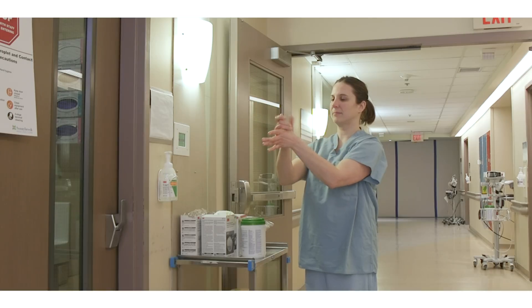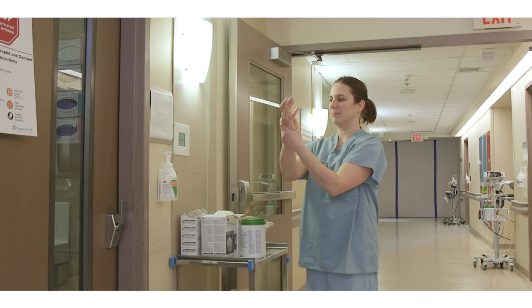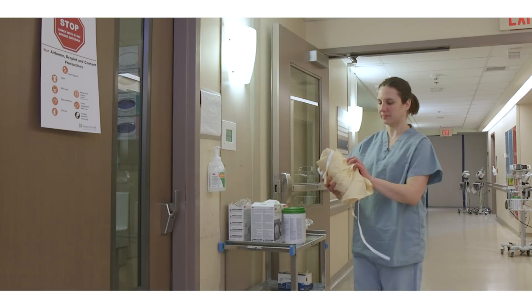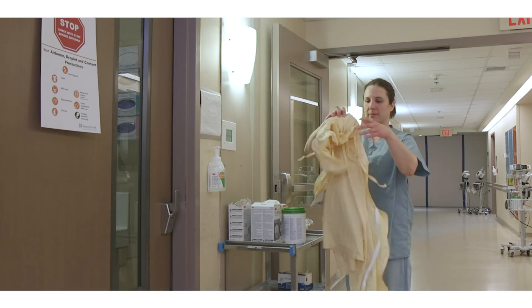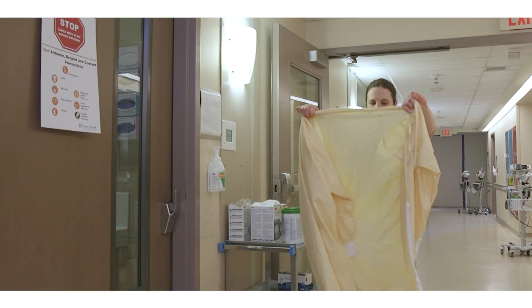Hand hygiene using alcohol-based hand rub is the preferred method. Use soap and water only when hands are visibly soiled. Tie back long hair if applicable. Do not bring unnecessary equipment into the room. Inspect your equipment for any damage prior to donning each piece.